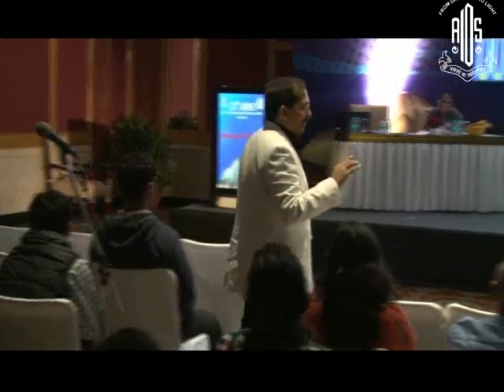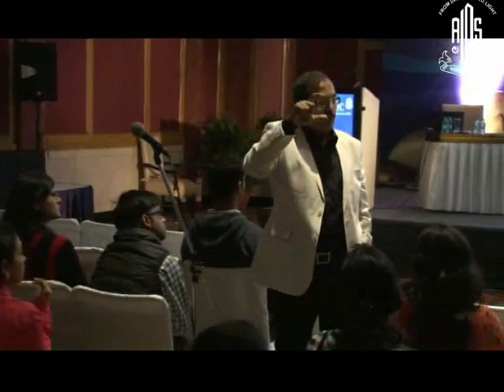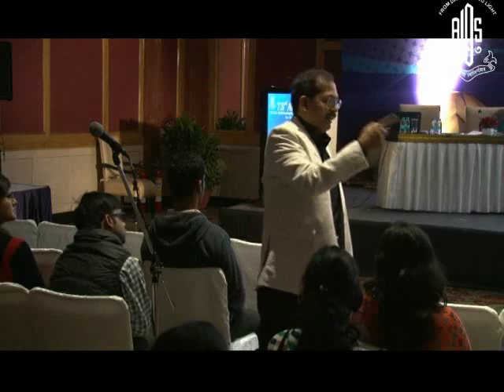Number one, you can try to change your technique, from LASIK to PRK. In PRK, of the 130 microns, 60-70 microns is only epithelium and Bowman's. Another 50-60 microns of stroma, which comes as a flap, you can ablate. So we can add another 60 and probably change the technique to PRK. So this case would be a case for PRK, not for LASIK.